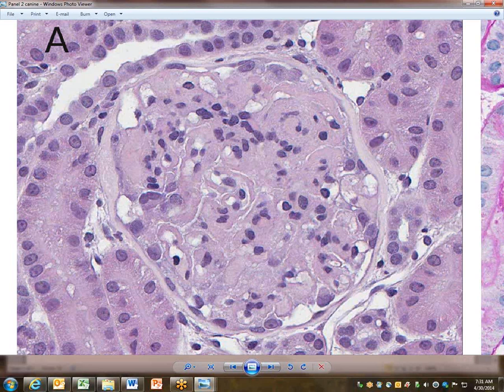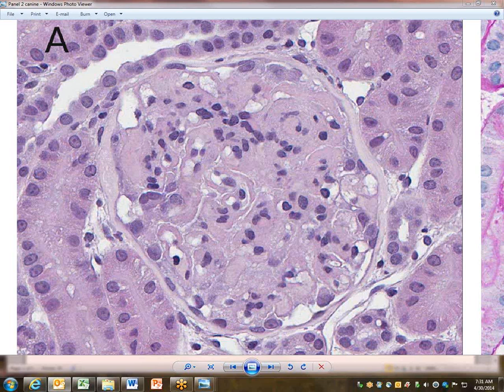I see. Do you want me to just give you mouse and keyboard control and let you just drive here? Okay. Since this is a case that wasn't really presented in the original paper, I'm happy to do this one because I don't want to scare anybody away.